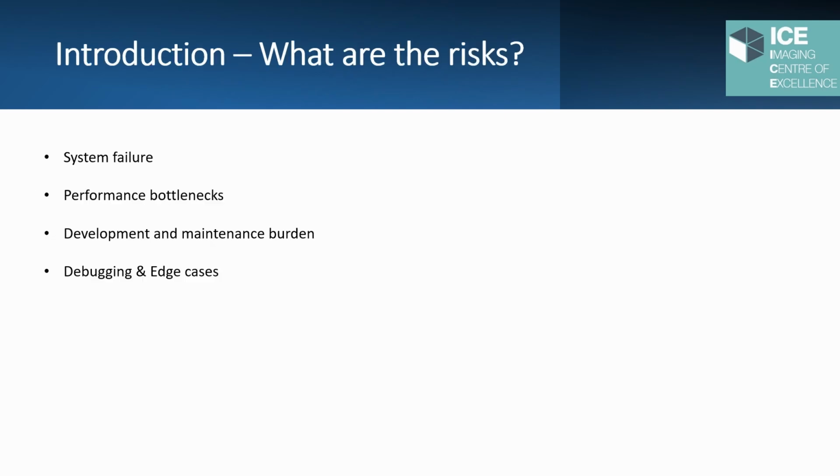I do think it is important to consider the risks of such a system. If it is a resource that many people rely upon for their work and it breaks down, then that will be a huge problem.